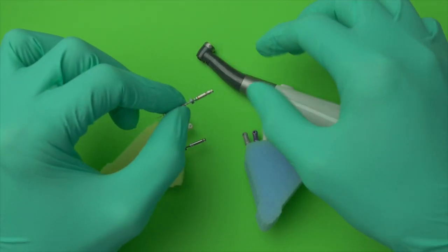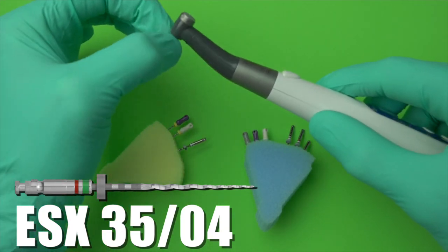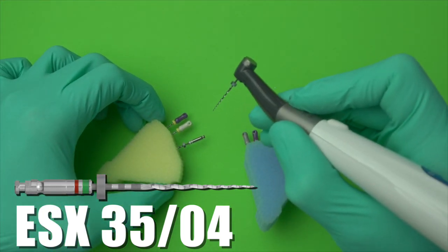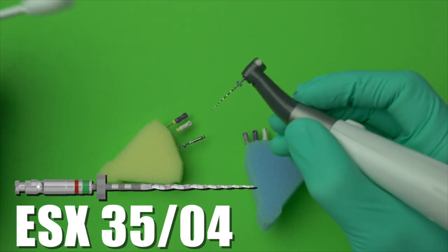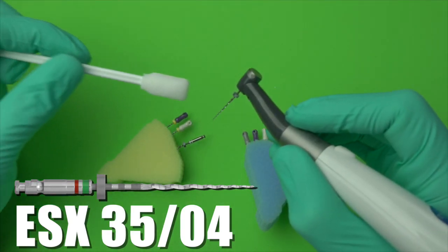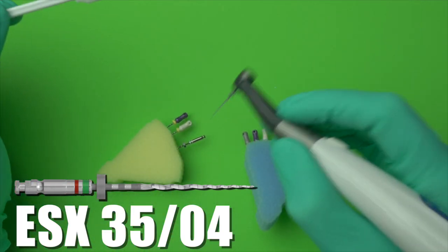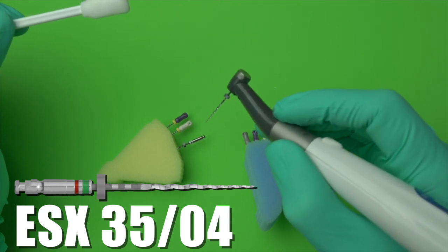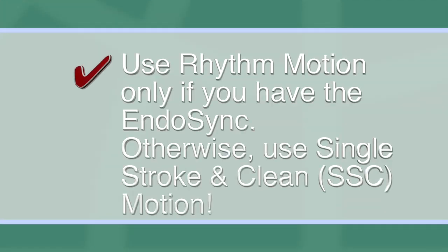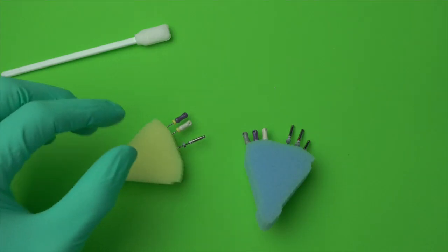Let's say I choose a size 35 to complete the case. I put the 35 in, set it to the working length, and using OTR with rhythm motion, work my way down to the apex. The key is to use the ESX file with a brush technique: rhythm motion of three strokes to engagement with OTR at 0.6, remove the file, wipe, do irrigation, and repeat until the file is down. That's basically the basic case workflow.